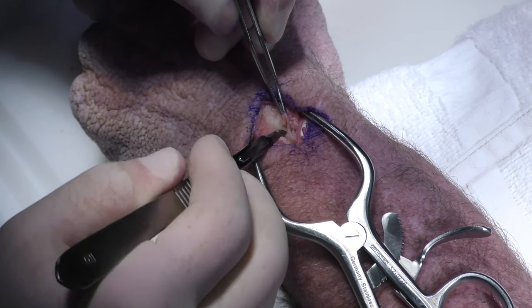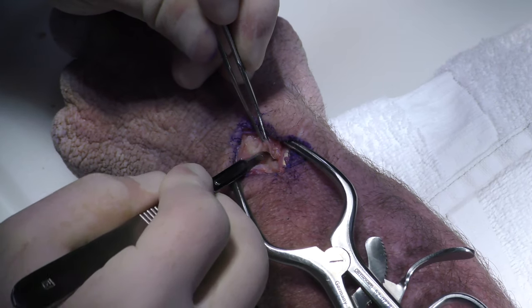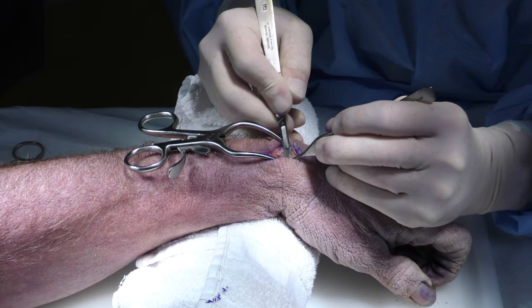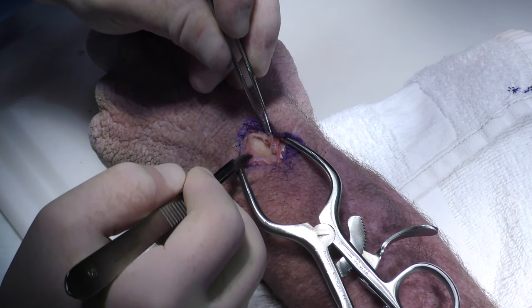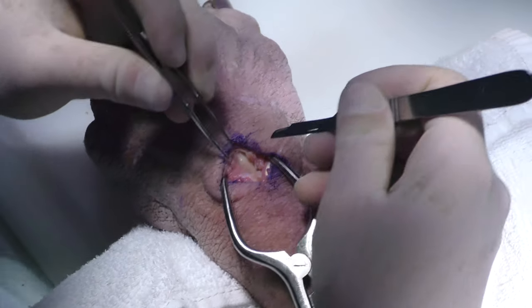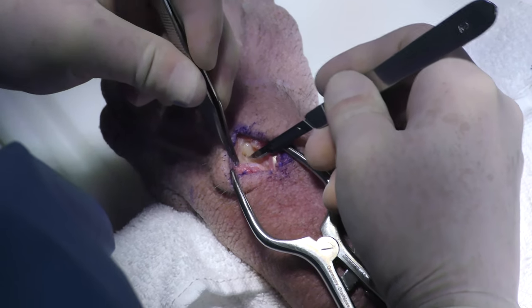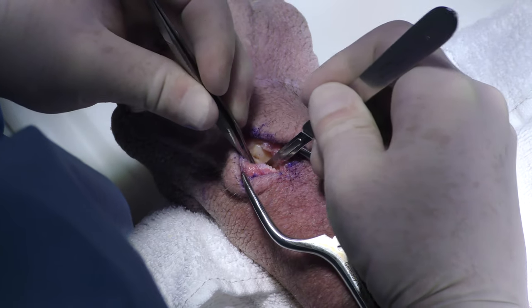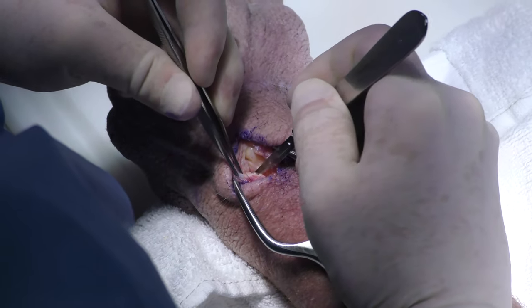So at that point, you want to make sure that your knife is tangential to the surface of the bone, because this is the scaphoid, and we'll expose a little bit over this way. This specimen has a partial scapholunate interosseous ligament injury already that we did not do.